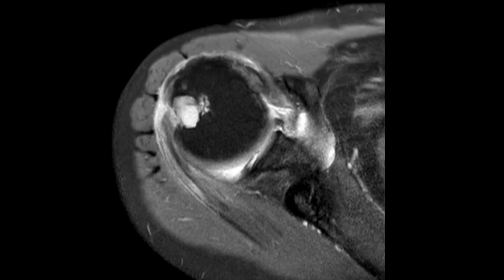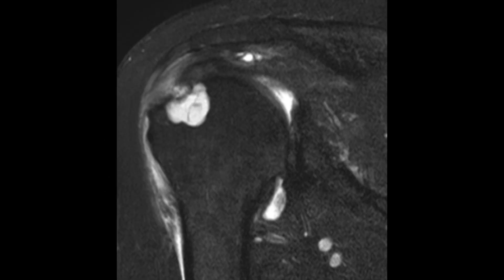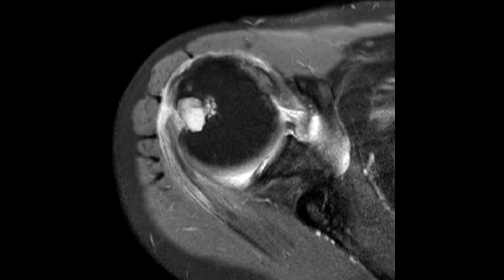Greater tuberosity cysts, such as this, can make it challenging to get fixation with suture anchors in rotator cuff repair surgery.